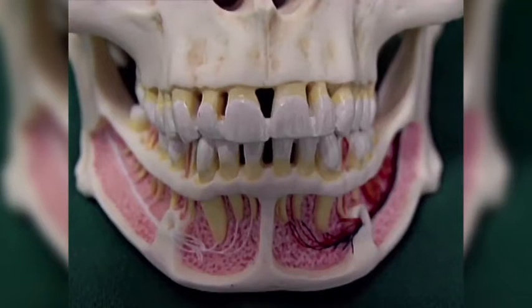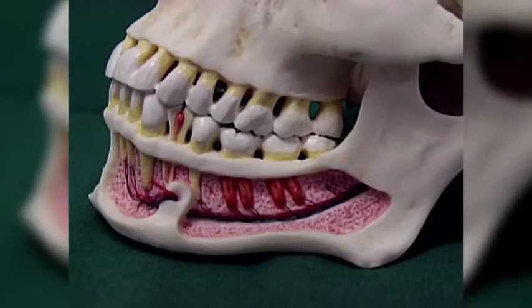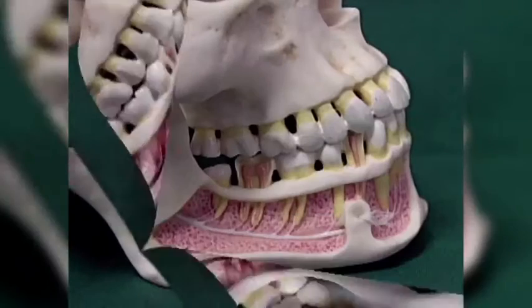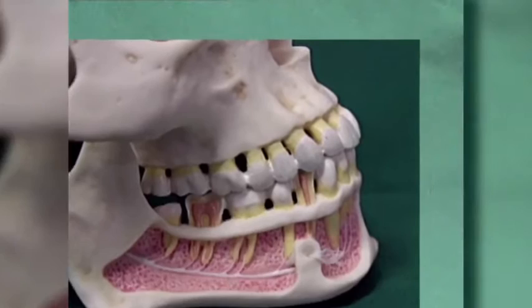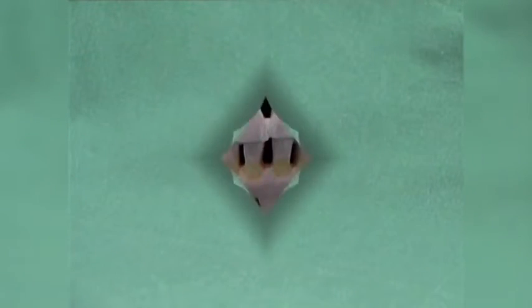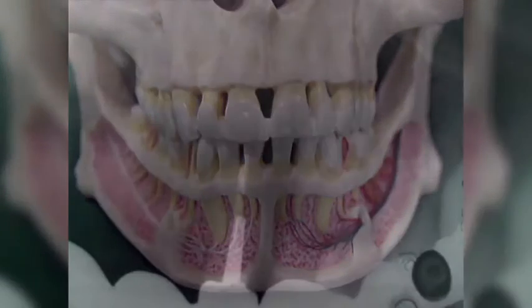We are showing clinical examples using the new SonicFlex retro tips on an upper incisor, an upper premolar and a lower molar. In the first example, a tooth requires an apicectomy and a retrograde root filling. The preparation of the retrograde cavity is achieved with SonicFlex retro tips.